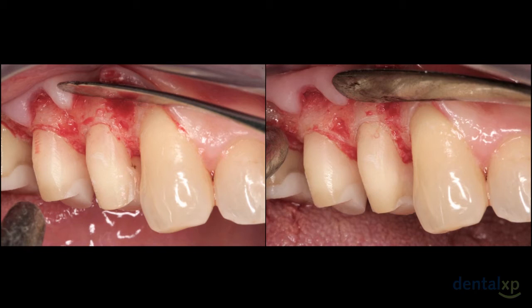Take a moment and look at the root surface and envision in your mind the way a piece of floss or the way a curette would work on this surface. It would be a beautiful surface to have any plaque or calculus removed with a curette or floss.